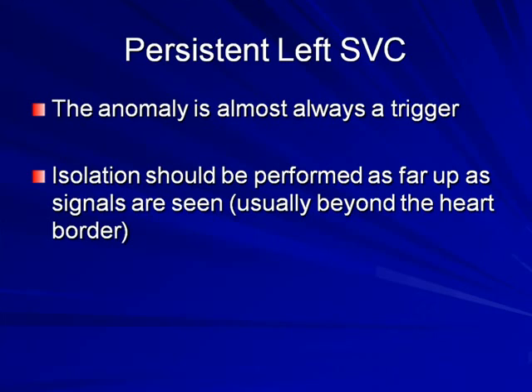So the point is that one of the movies I was hoping to show you was the process of isolating the left SVC in a patient we were treating who had long-standing persistent atrial fibrillation by history. As we isolated the SVC, before we even accessed the left atrium, the patient's atrial fibrillation terminated and we were no longer able to induce it at that point. We did opt to go over to the left atrium and isolate those veins, but the SVC in that particular case was playing a very dominant role in maintaining the fibrillation.